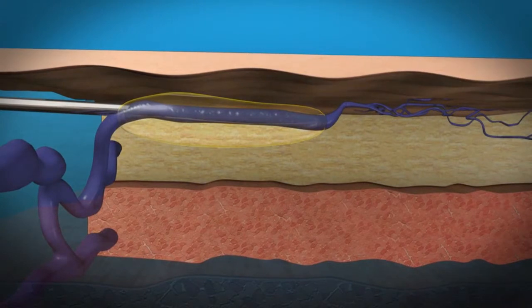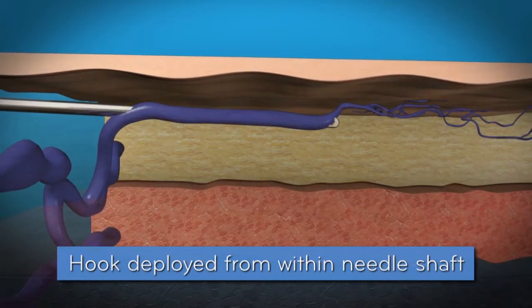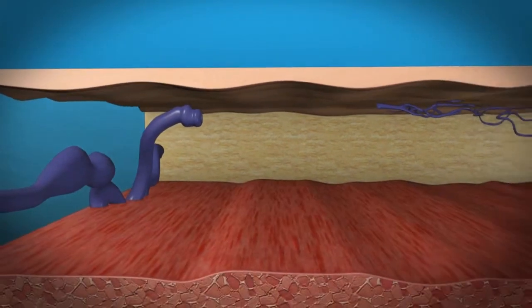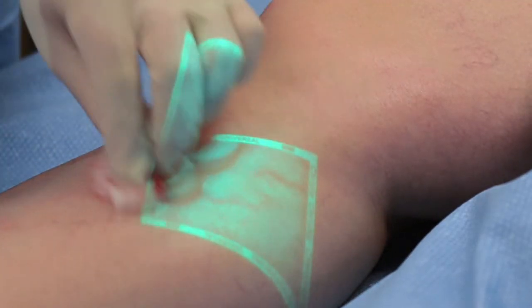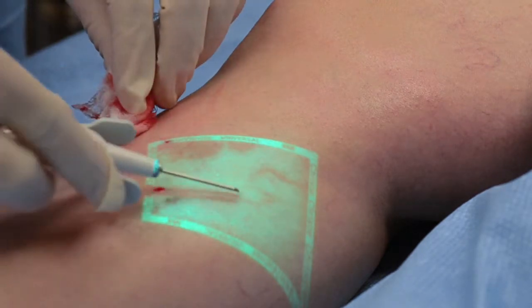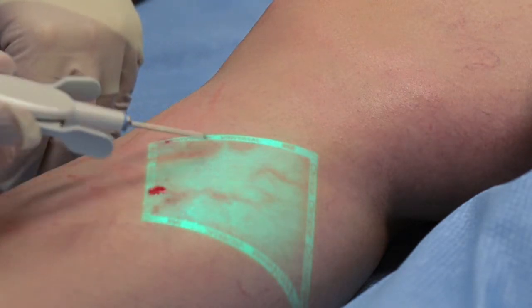This is performed with the levers not depressed, so the hook is not deployed. Once in appropriate position, the levers are depressed, which causes the hook that resides within the shaft of the needle to be deployed. As the device is retracted, the hook grabs the vein under the skin and disrupts it. This is represented by a small amount of bleeding from the insertion site. The levers are then released and the hook retracts back into the needle. The VenX needle is then withdrawn and advanced to the next target area.